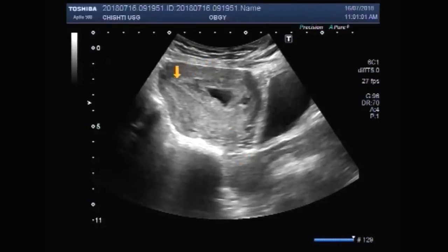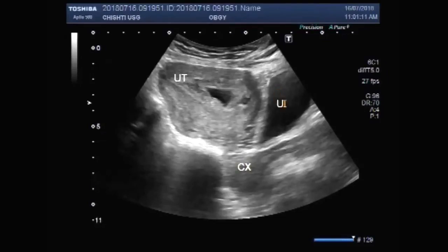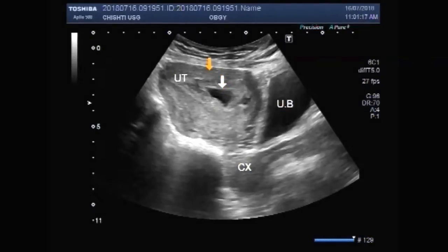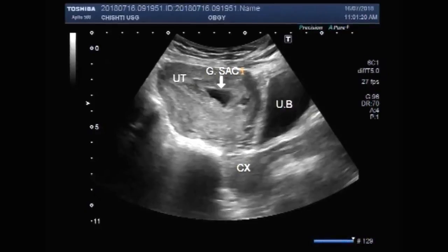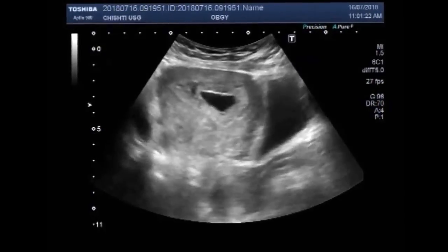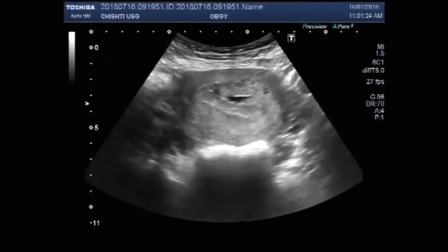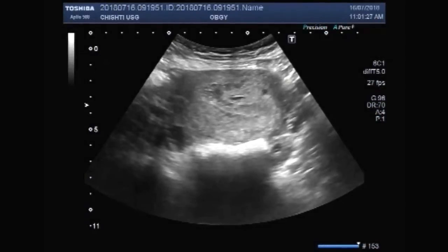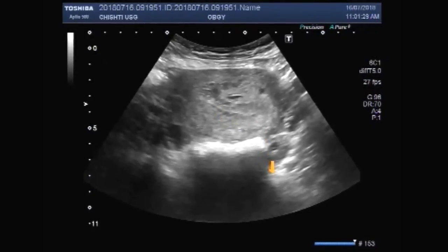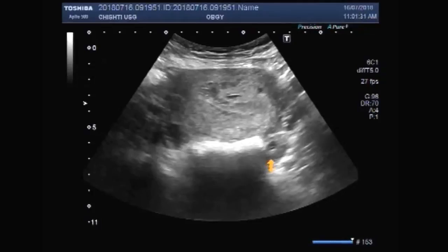A blighted ovum is a fertilized egg that implants itself in the uterus but doesn't become an embryo. Blood and urine pregnancy tests look for HCG, so a blighted ovum can result in a positive pregnancy test. It is an anembryonic gestation, also called an anembryonic pregnancy, where the embryo never develops or develops and is reabsorbed.